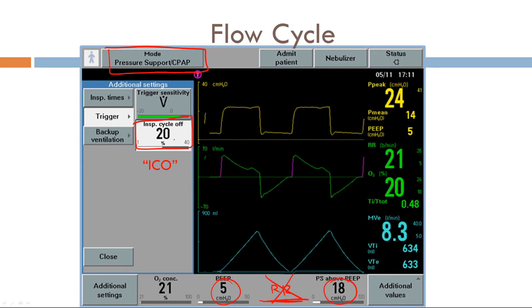Again, the cycle variable in pressure support is flow. Well, so we look at the peak inspiratory flow here. This is what we regard 100%. Once the flow reaches this set amount, or 20%, of your peak inspiratory flow, there's cycling of the breath. It means you stop inspiration.